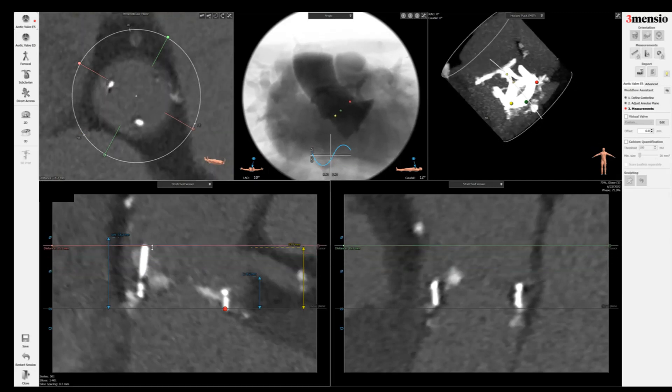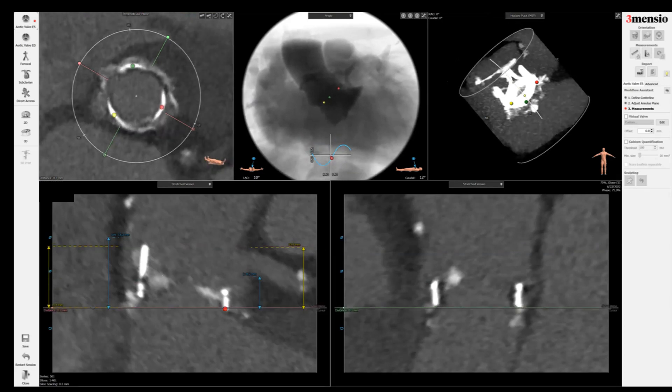Next, I'm going to go to the top of the surgical valve — this is roughly 16 millimeters here. I do a custom length measurement, bringing it down to the bottom right back to the annulus. This is kind of the height of the surgical valve.